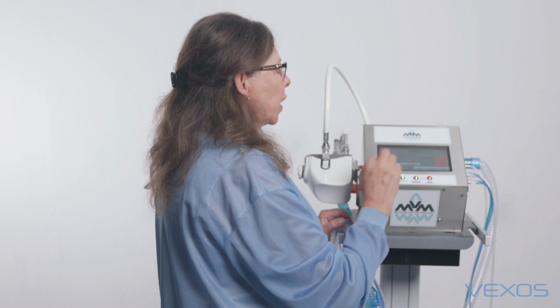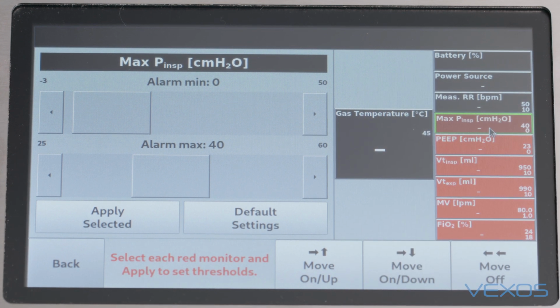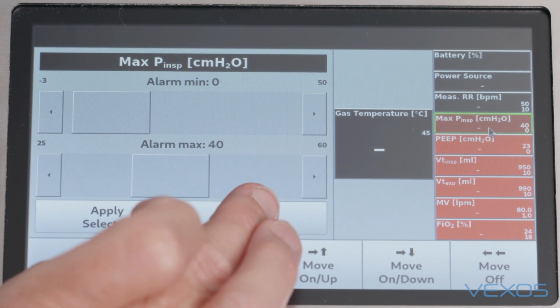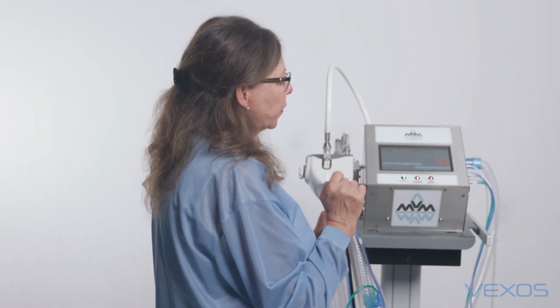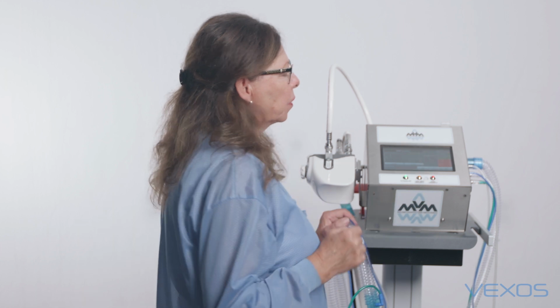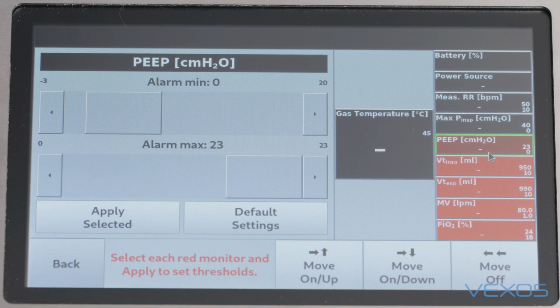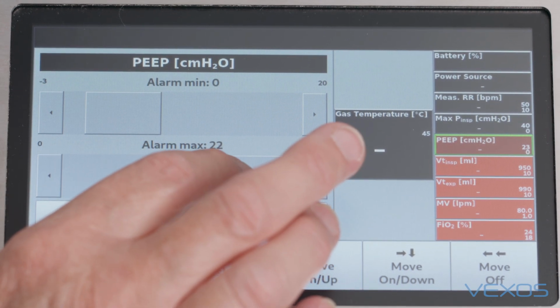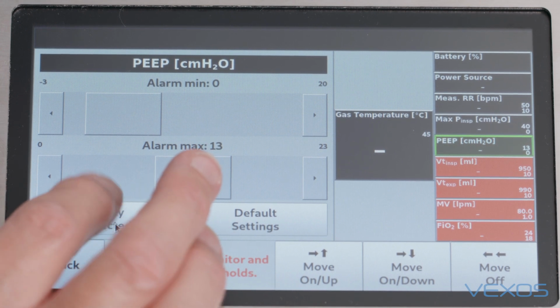I'm going to select those, and I'm going to go to the next one, which is the maximum inspiratory pressure. Again, I can choose default settings, or I can change the settings by dragging these bars for minimum and maximum. Even if I were to choose default settings, I still have to apply. That's done, and I'm ready to move to the next one, and that maximum pressure has gone back to black. The next one is PEEP. The PEEP alarm, again, would be set either by choosing default, which are settings that are factory set, or again, I can drag these tabs to set what I want. Apply selected has to always be done, and I go on to the next one, which is the inspiratory tidal volume.